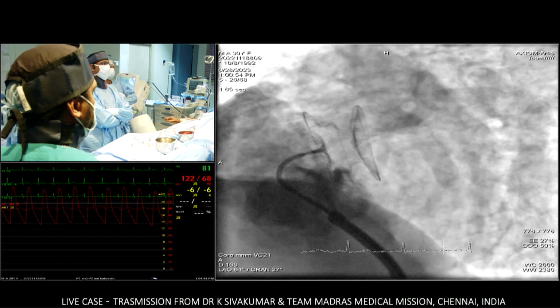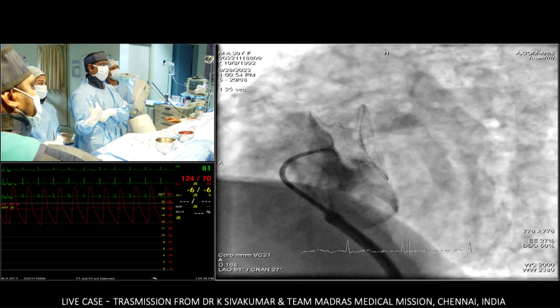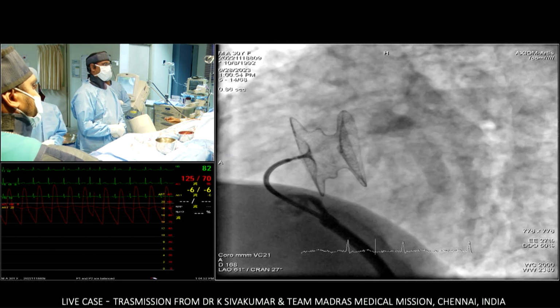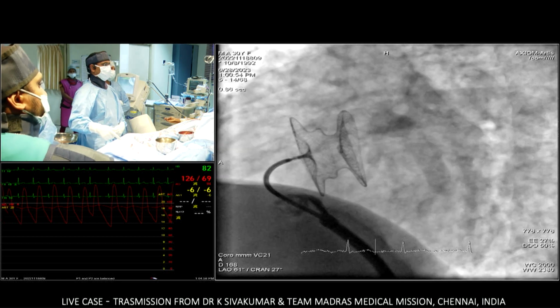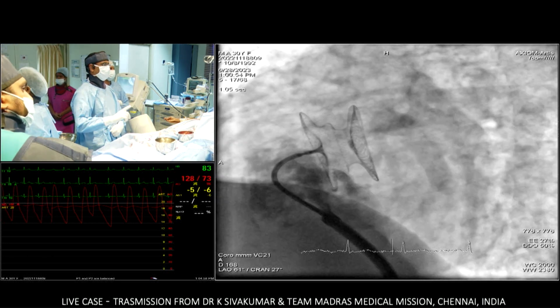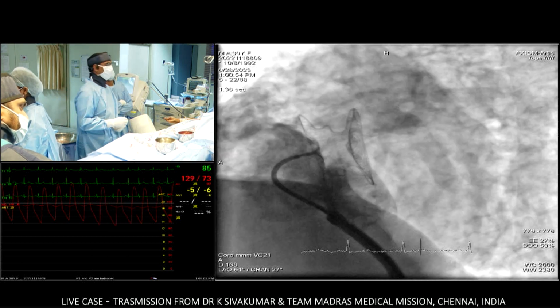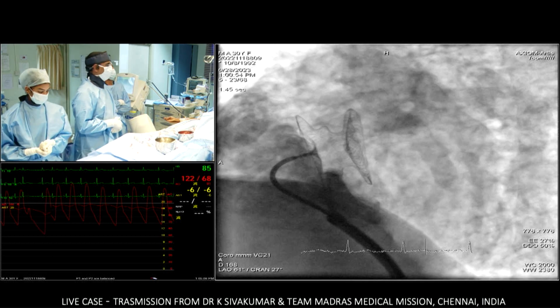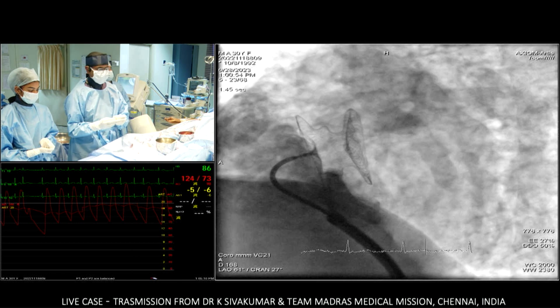Shiva. Yes. I'm going to be pretty stupid now, but just looking at the discs, looking at the TOE appearance, the two discs seem to be quite a distance apart for that thin septum. Go next. Am I being stupid? But let us see on the transthoracic echo. It doesn't look very bad. I'll show you now a transthoracic echo. I will also, in the meantime, show this device.